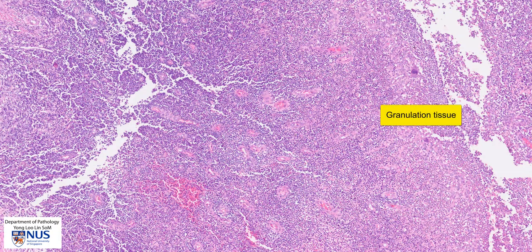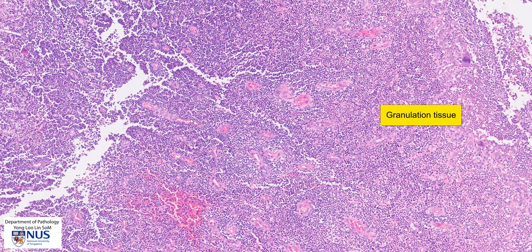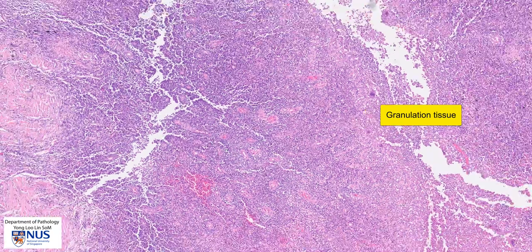Another feature that may be seen, particularly in the periphery of an abscess, is the presence of granulation tissue. At this magnification, we can see some of these small, immature blood vessels, which are quite leaky. This is granulation tissue, and it is part of the healing process from inflammation.